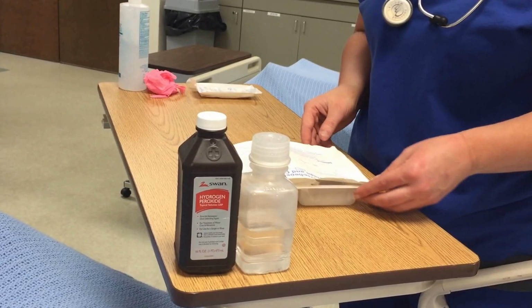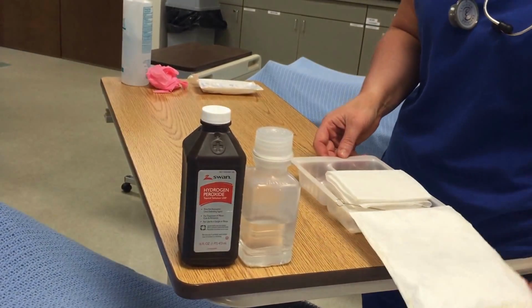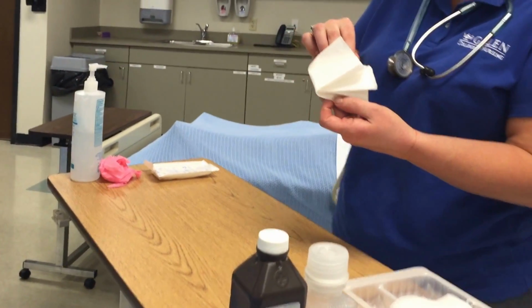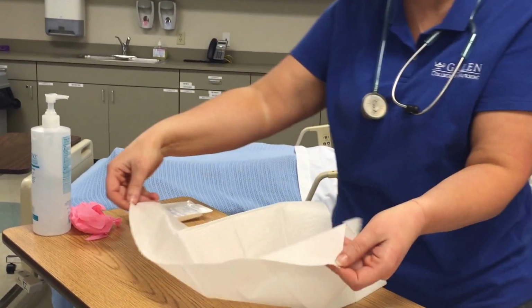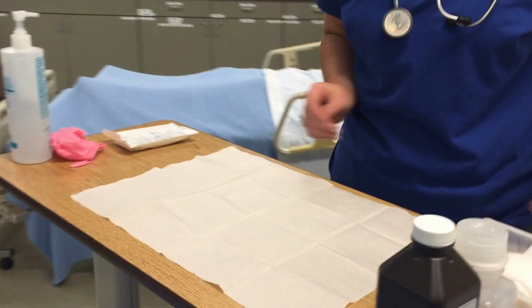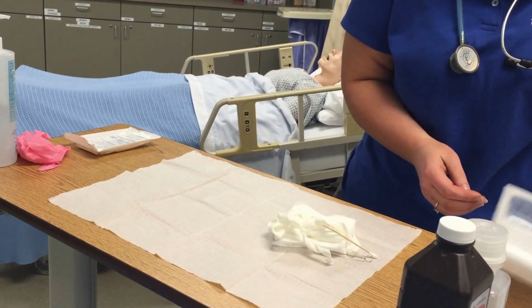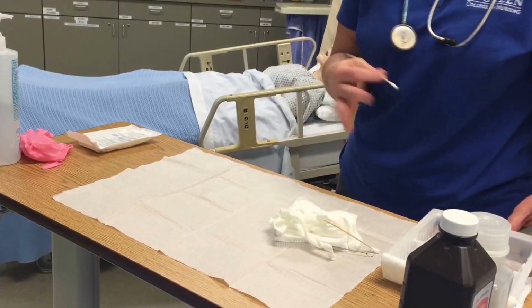Put this over here. All right, what we're going to do is open this up here for a second and just pull this out and open this up to where you have shiny side up, and then just let it fall. You don't want to contaminate your sterile field at all. Okay, and then you just want to take your contents and just dump them onto your field. And ideally dumping them all and getting them all on there.